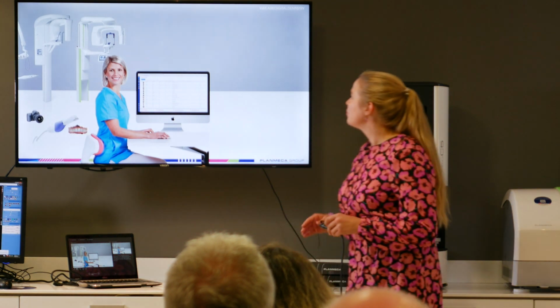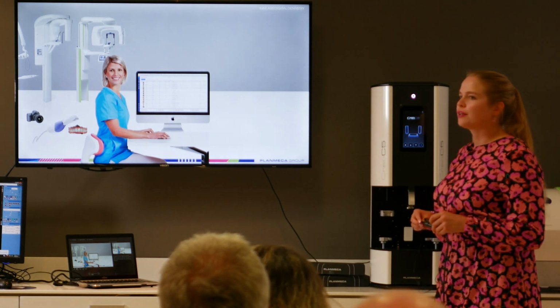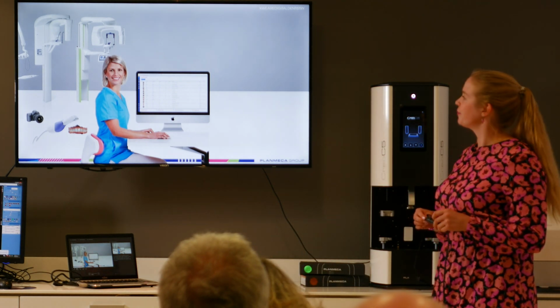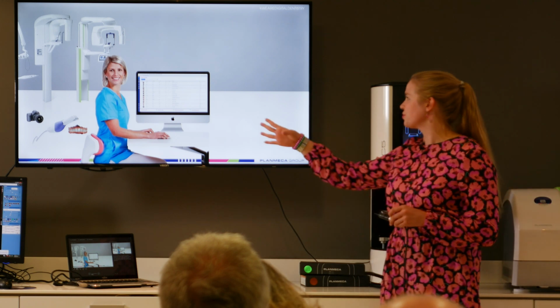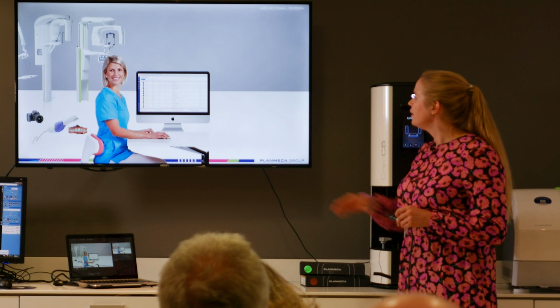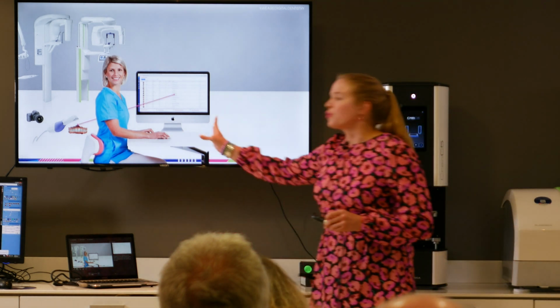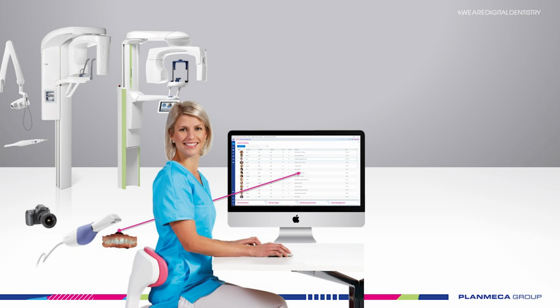And finally, about data capturing devices, intraoral scanners are getting more popular at dental practices. So we have also our own Emerald S intraoral scanner. So also these digital dental models we could directly capture to Romexis database and we could work on them.